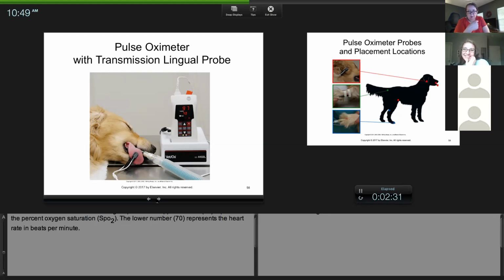I've pulled out the probe and someone's like, oh my gosh, my reading's really bad. And we pull out the probe and it's covered with stool. I'm like, okay, let's wipe it off and then we'll reassess. Are we really concerned? A lot of times you clean it and then put it back in and it's normal. This is the clothespin.